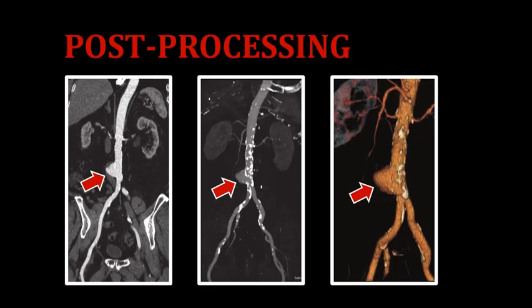As with all angiography studies, post-processing is an important part of this scan. In fact, one of the defining characteristics of an angiography study is the post-processing. Here I have an example of three different post-processing procedures that are commonly used for angiography imaging of the abdominal aorta. The image to the left is a simple coronal reformation of the entire study, and the red arrow is pointing at a sac-like aneurysm just above the bifurcation of the descending aorta. The image in the center is also a coronal reformation, but this is a MIP image — a maximum intensity projection — and you can see how this really makes the image look different, with the arterial structures really standing out.